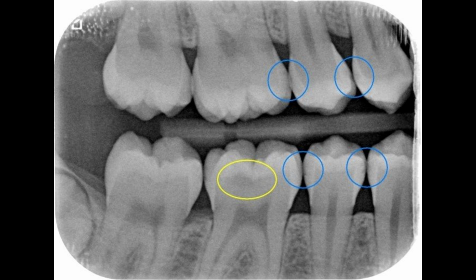Here we see the darkness between the teeth. These are cavities. You can look at the circles, the blue circles, they'll show us the cavities between the teeth. These cavities are very small. Often the small cavities won't be seen clinically during an exam. They may or may not be giving the patient sensitivity or pain, and often a dental x-ray is the only way to detect these cavities.